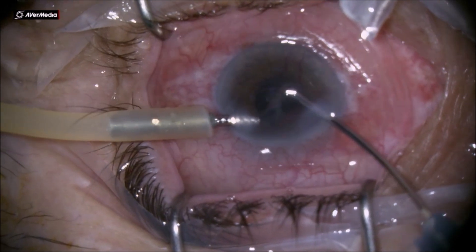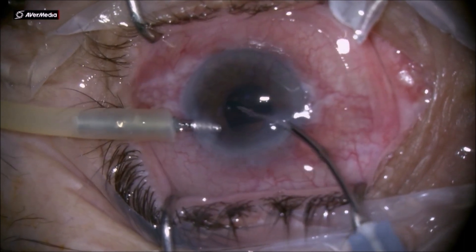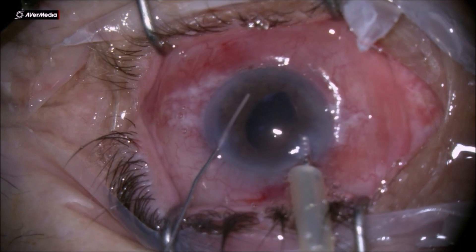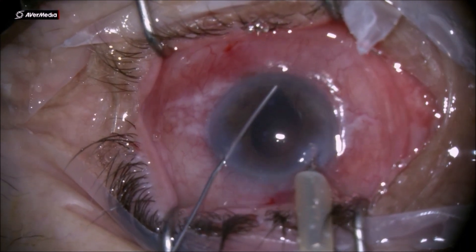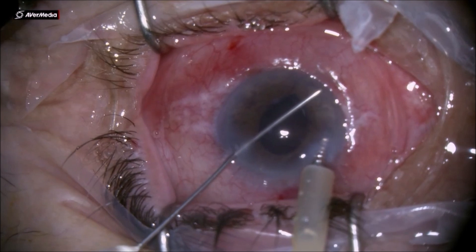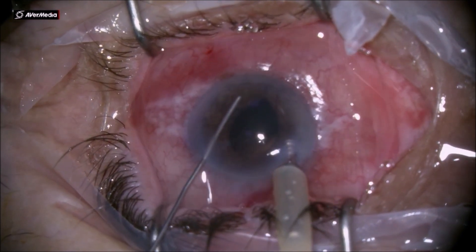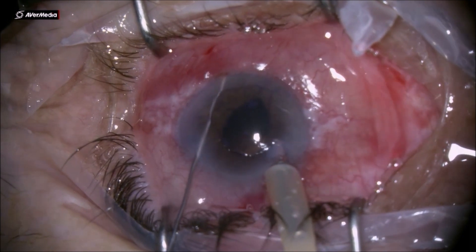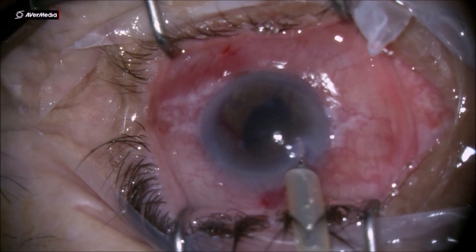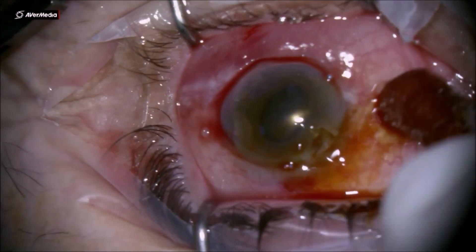At the end of phacoemulsification, I usually use a needle to press the root of the iris back in order to break the anterior synechiae. In neovascular cases it's almost unavoidable — when you do this maneuver it's nearly impossible not to rupture some new vessels. However, that's not a big deal: you can inject some diluted adrenaline and an air bubble to assist in getting the bleeding under control. Thank you for your attention; I hope this will help you in your practice.